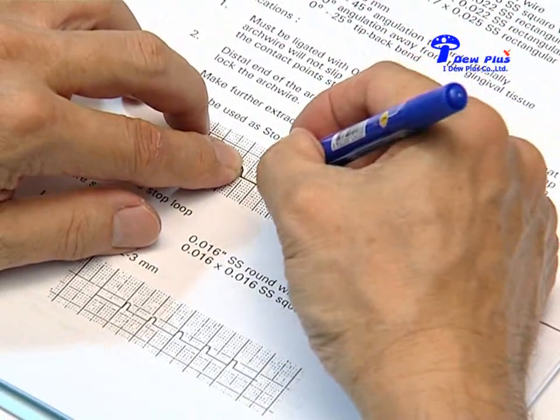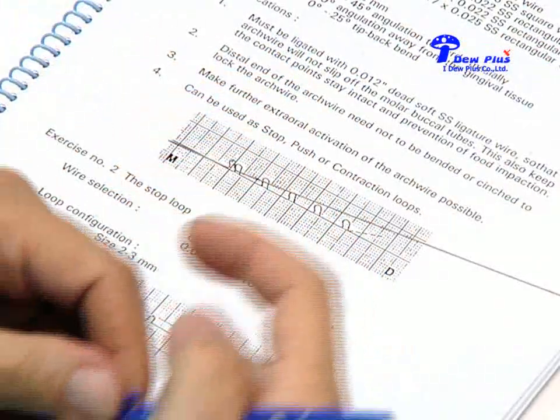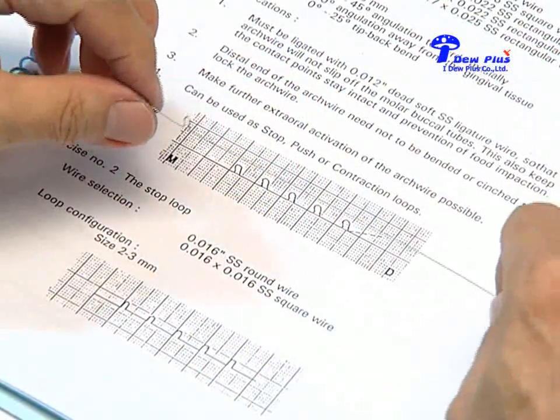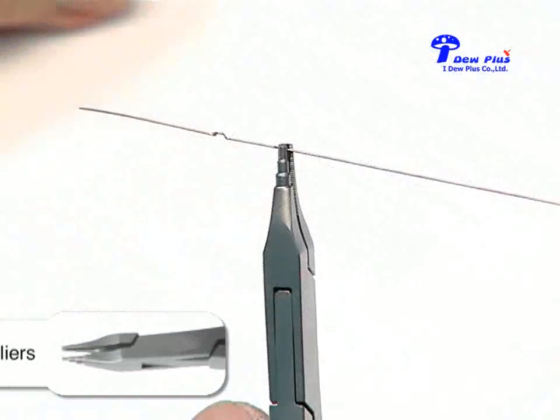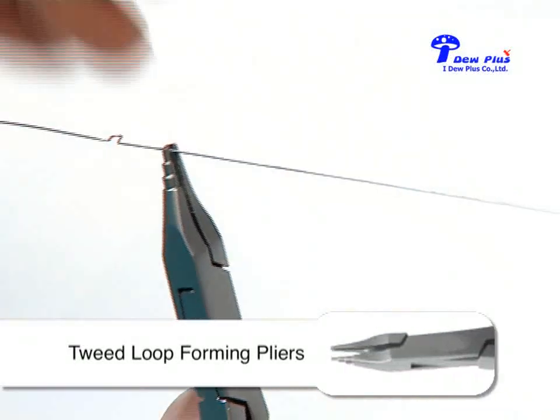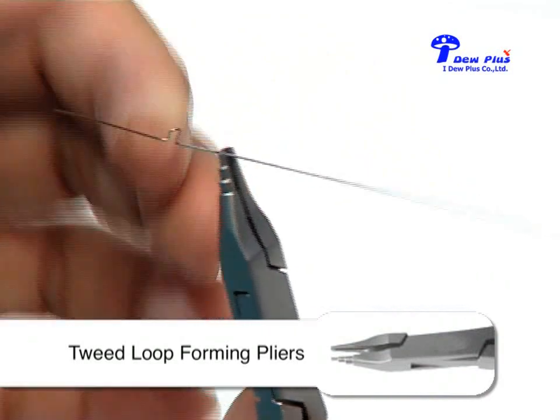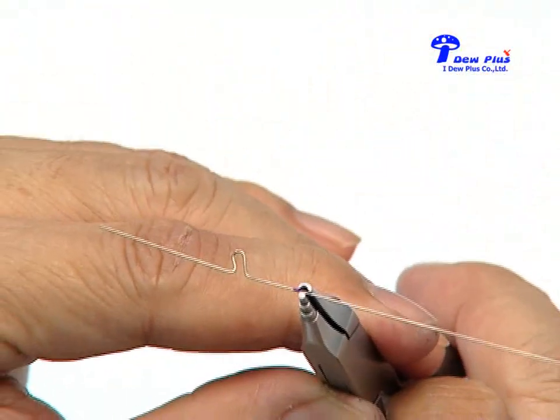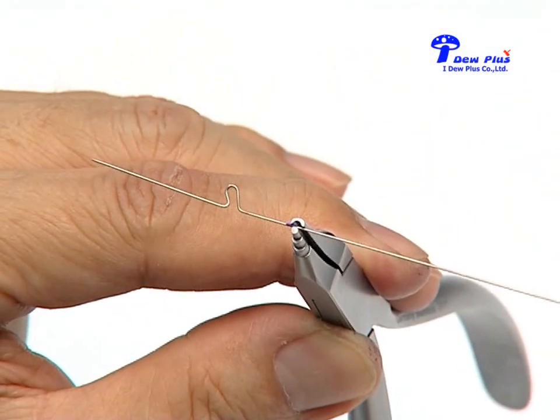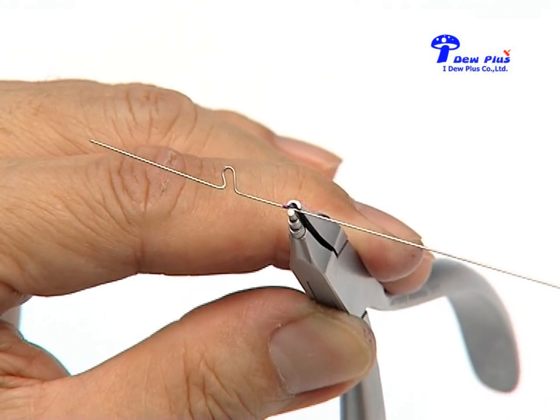This exercise will be repeated 5 times. This is to practice the coordination between the eyes and the fingers. Again, we are practicing. We will do the second loop. Again, we want the loop to stay up, or gingivally. So you have to place the round beak down, on just the opposite side. The round beak will stay occlusally.